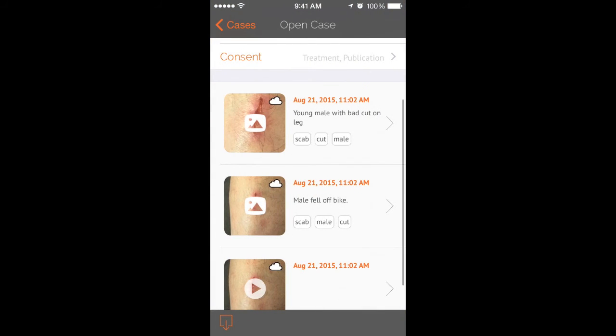I hope you've enjoyed this short video on how to add keywords and annotations, as well as how to organize your images into patient cases using the Modica app.